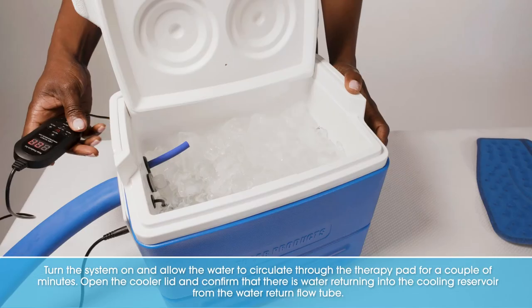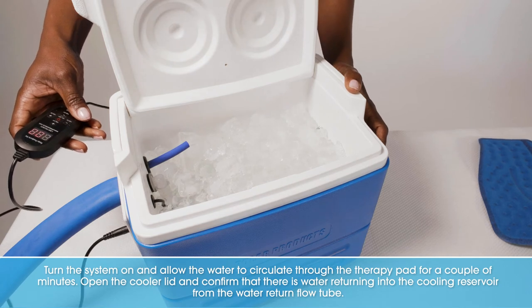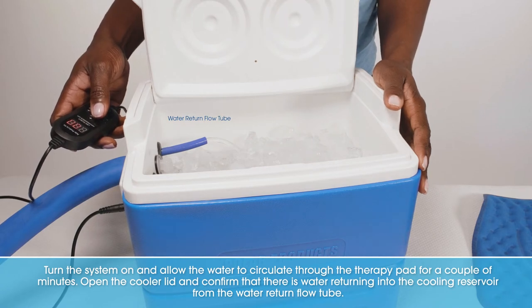Turn the system on and allow the water to circulate through the therapy pad for a couple of minutes. Open the cooler lid and confirm there is water returning into the cooling reservoir from the water return flow tube.